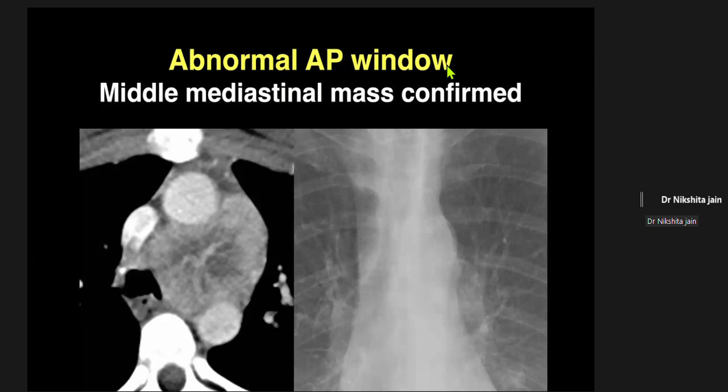Got it. So the next question is, what does the acronym AP stand for? And is there an AP line on the right side as well? Oh, sorry. AP stands for aortopulmonary. I'm sorry, I should have said that. So it's the aortopulmonary line, the aortopulmonary window. That's what the acronym stands for. And there is not an AP line on the right, as far as I know.